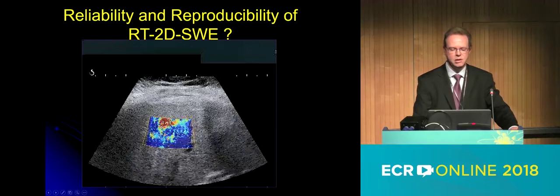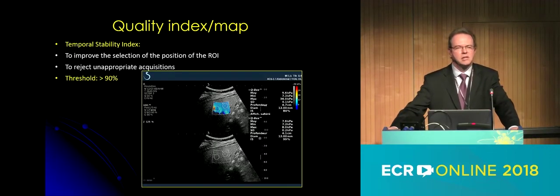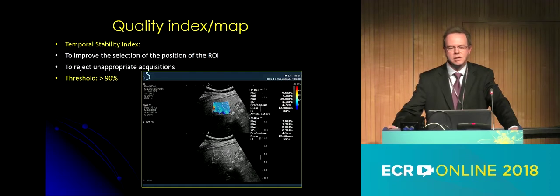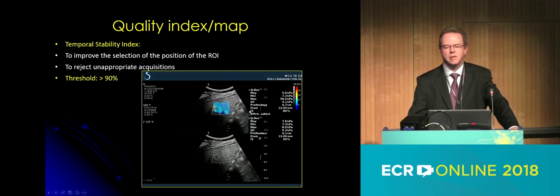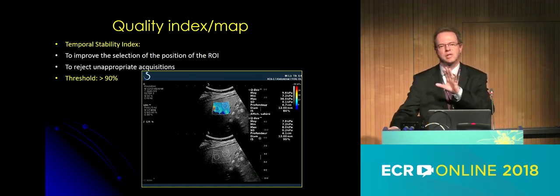But in addition, the vendors added an additional index, the temporal stability index, which helps us to find the area of measurement which is the most stable.